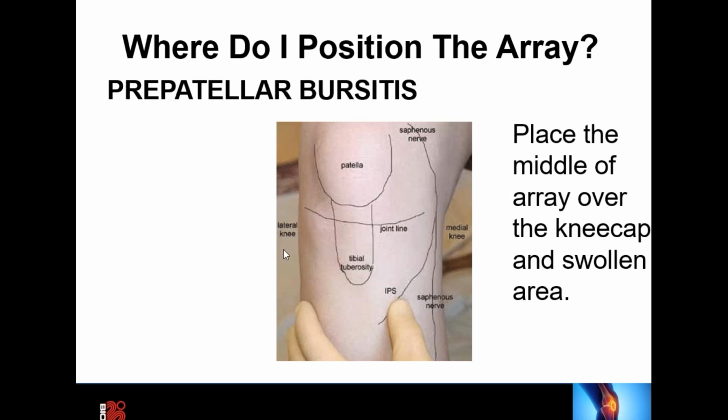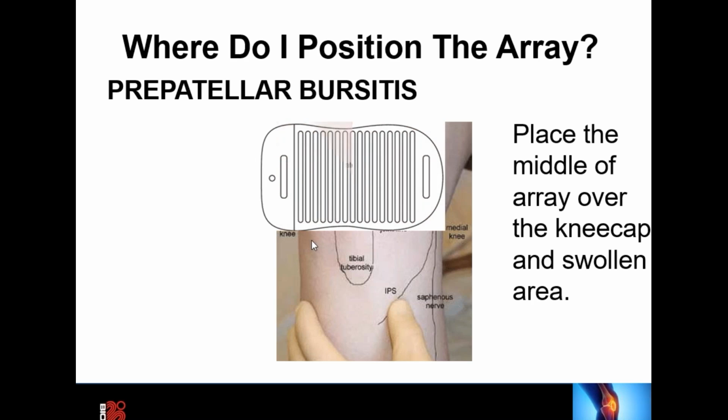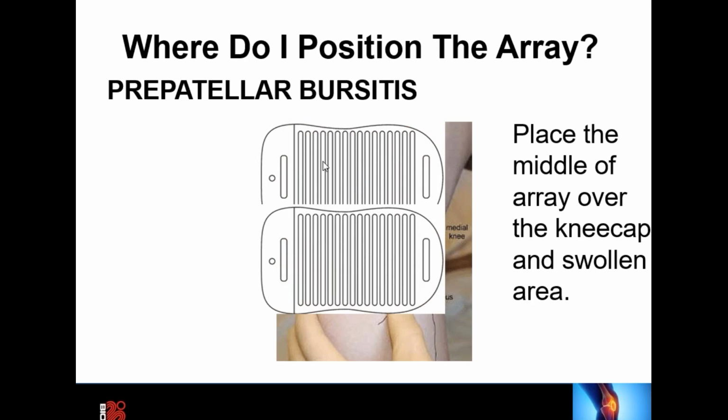For pre-patellar bursitis, it's really obvious where you're going to treat. You're going to treat over this patellar region. I usually recommend placing the array over the swollen area, and that usually involves 2 placements over the patella and just beneath the patella to capture the entire swollen area.